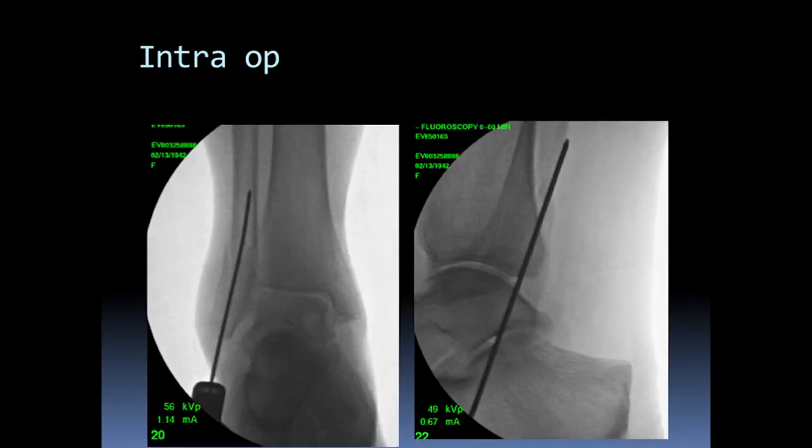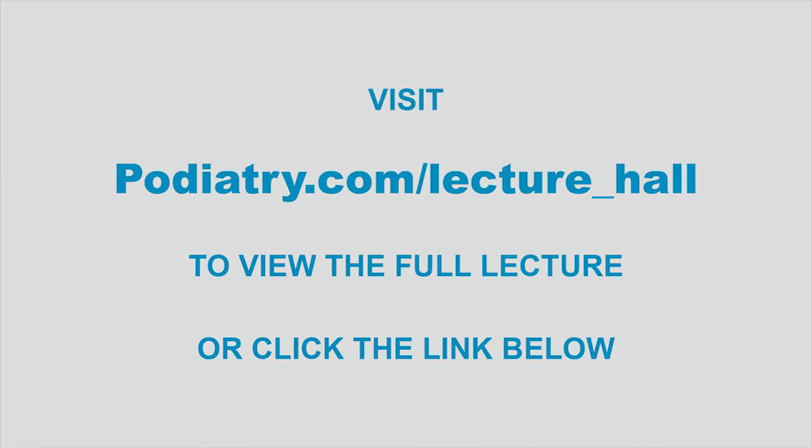And here's a really good example of it looking pretty good on the anterior-posterior view. But look at the back of the ankle. You know, the wire was sticking out. So we had to now readjust that wire so that it went straight up the fibular canal, not only in the anterior view but the lateral view. And I show this because this is a common mistake intraoperatively that you do not want to have happen.